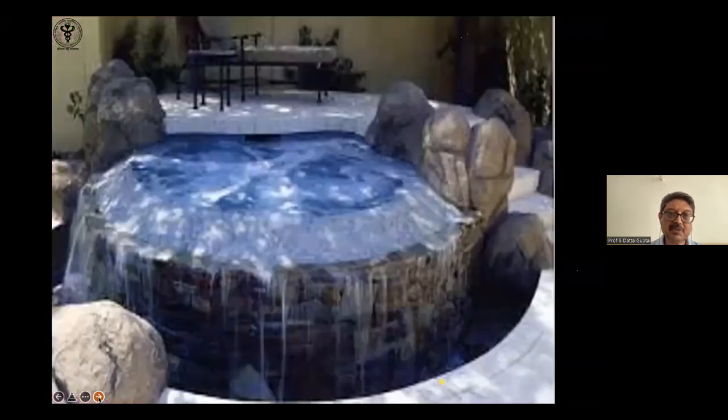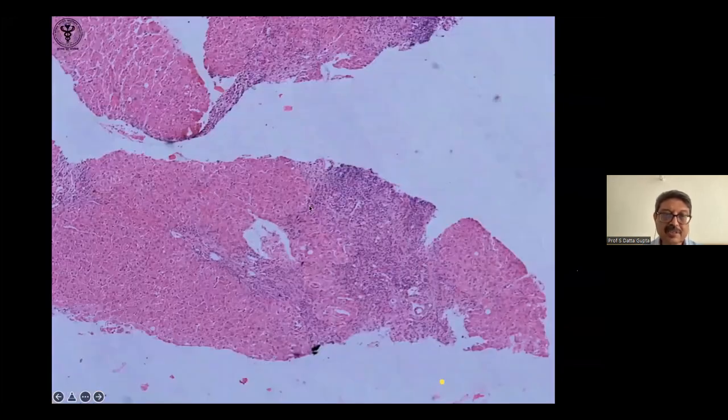See, piecemeal necrosis is almost like water overflowing there. See this? Fairly severe here. And this is what I was telling you about in patchy disease. So this is so severe here. In this portal tract, the piecemeal necrosis is mild. And here also mild.